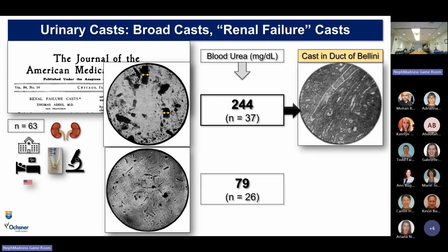He also has some tissue diagnosis that, believe it or not, is one of the few pieces of data in the entire medical literature where you have a correlation between urine sediment and tissue, where you have those casts of waxy appearance, including the ducts of Bellini, and the beginning of understanding that this is the waxy cast form deep in tissue when the tubules approach the collecting system.